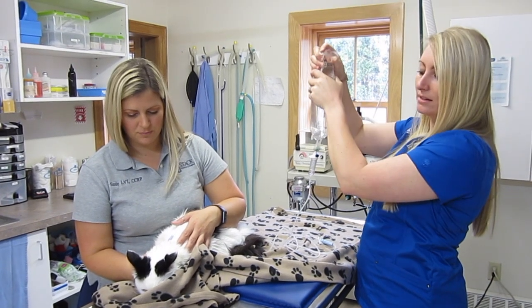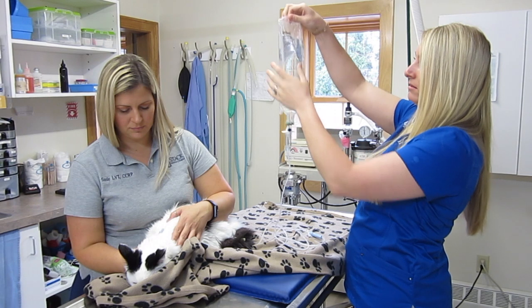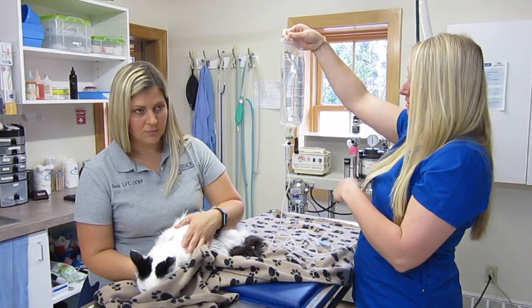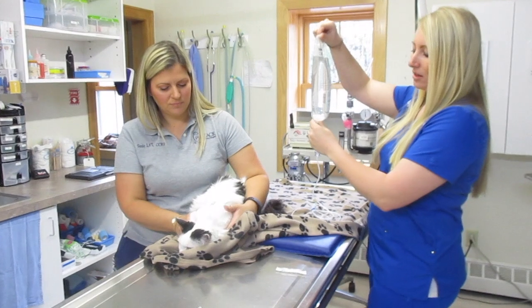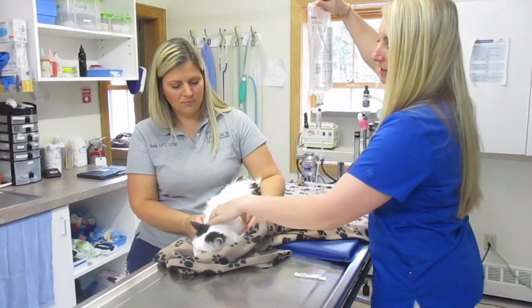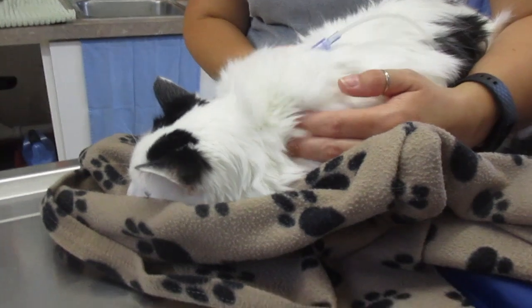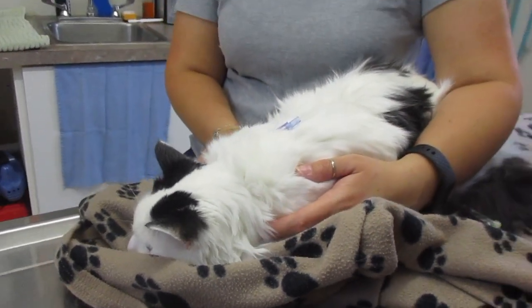If your patient's not necessarily tolerating this well, you can go a little bit slower. You can just let it hang by itself if you are by yourself. Again, if you're hanging it on a cabinet or on a hanger, you can just let it flow. It'll just go a little bit slower. All right, so as the fluids are going down, you will see that there will be a nice little bubble here right in the scruff area. Basically, the fluids are getting absorbed, and as the patient needs those fluids, they will absorb throughout the rest of the day.